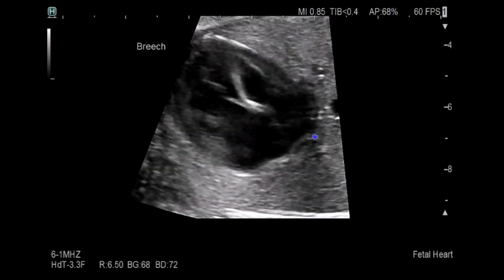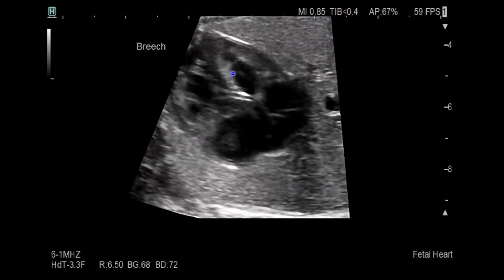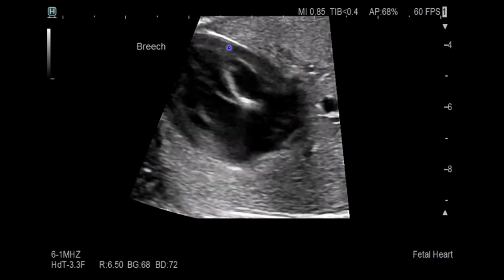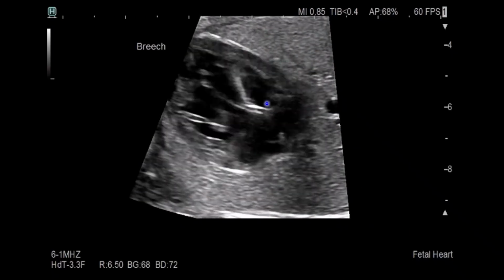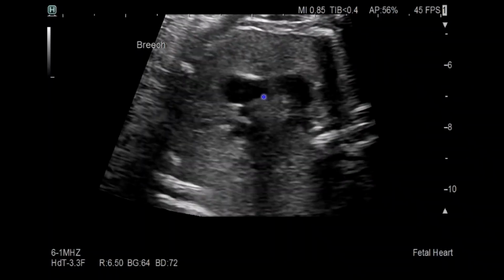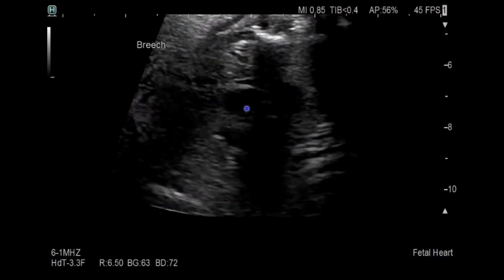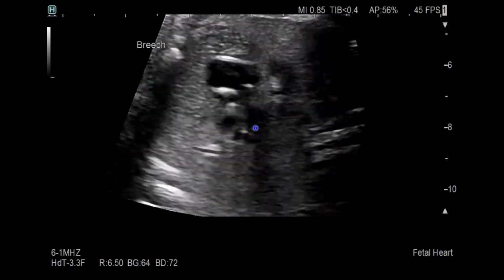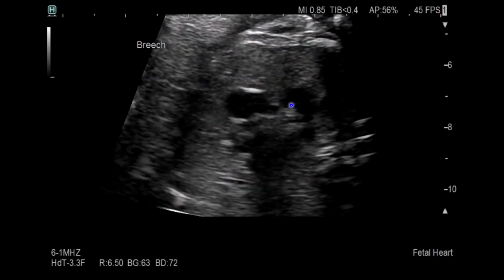This case is a case of hypoplastic left heart syndrome. Again, the LV is not contracting very well, and it is hypoplastic, does not meet the apex. And so you see here some endocardial fibroelastosis of the LV. And when you look at the upper chest view, and so the three-vessel tracheal view, we're transitioning to, this is the MPA here. You see part of the RPA there, and so this is left, this is right. And we're seeing this tortuous looking larger ductus coming around.